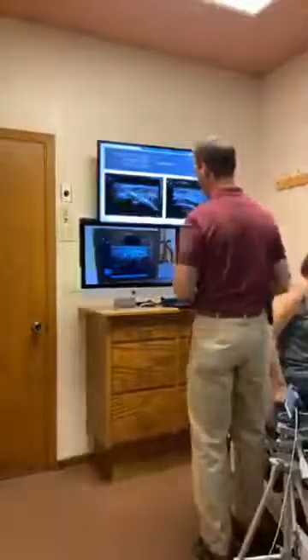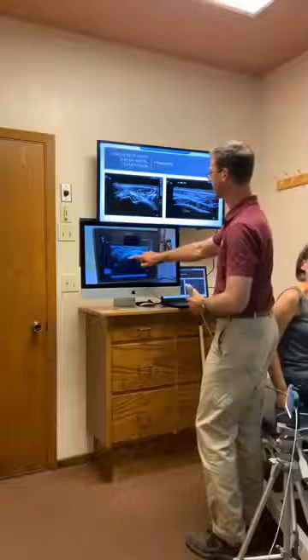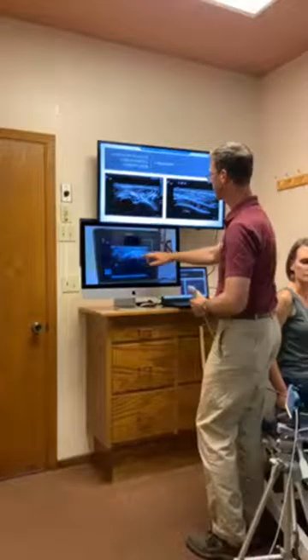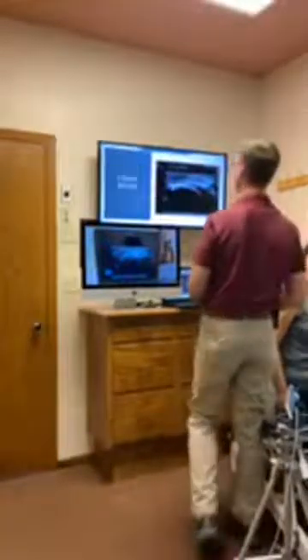All right, so here again, this is now a short axis view, and you can see this nice white area. It's normal. You can also see the cartilage here. That's the little darker line under it, just above the bone. So that's a normal tendon. So looking at a strain.